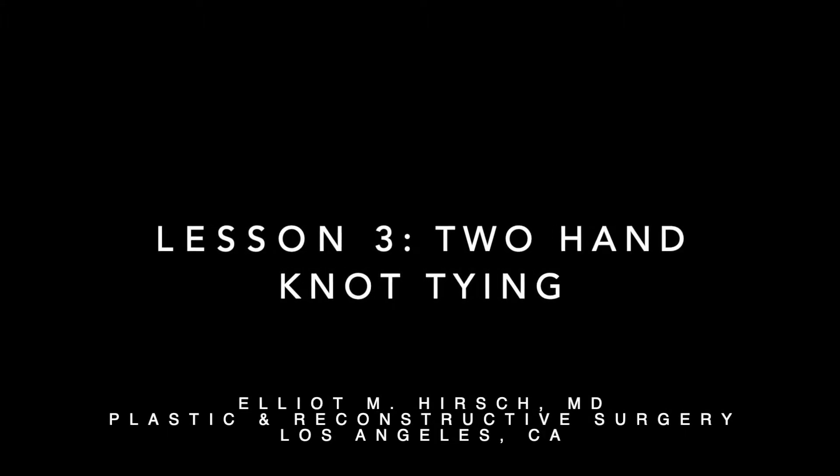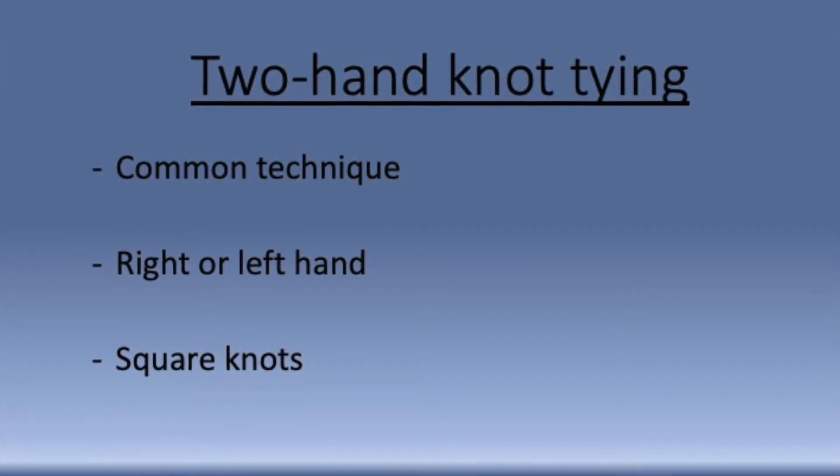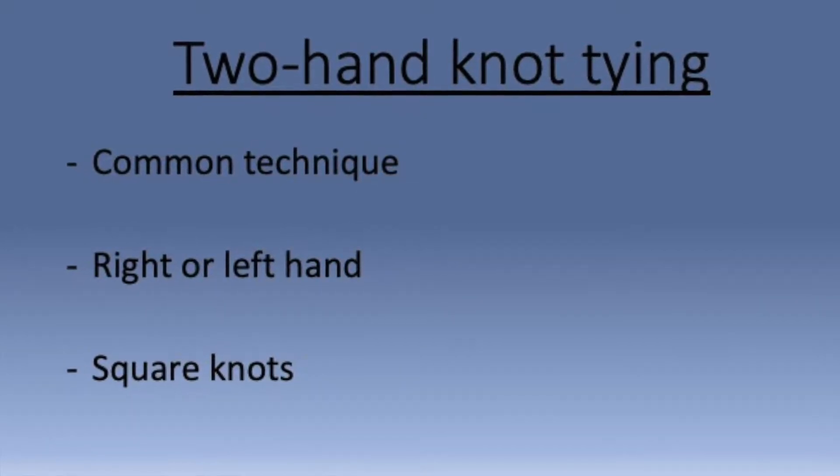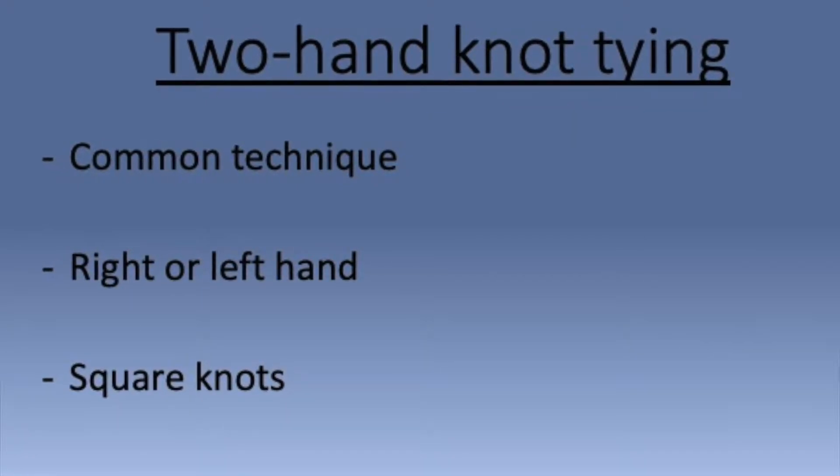This video reviews two-hand surgical knot tying. Two-hand knot tying is a very common surgical technique. It can be performed with either the right or left hand and is very popular in people who are learning how to suture and knot tie because it's easy to tie square knots with this technique.